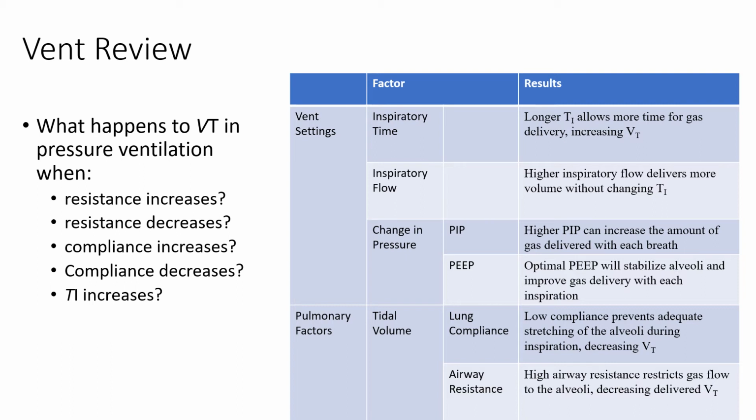So before you go any further, you're going to want to make sure that you know what happens to your tidal volume in pressure ventilation when your patient's resistance increases or decreases, your compliance increases or decreases, or if your inspiratory time increases.